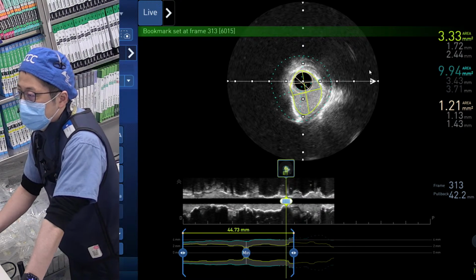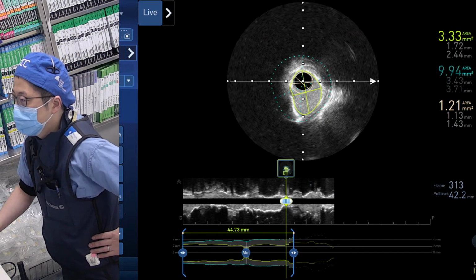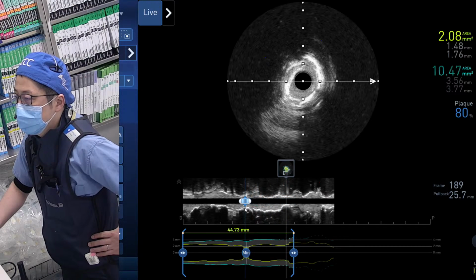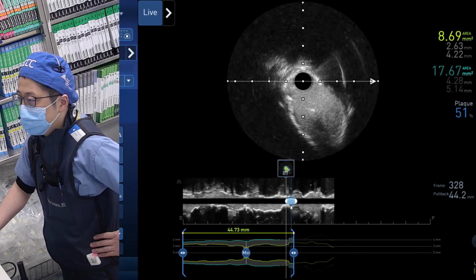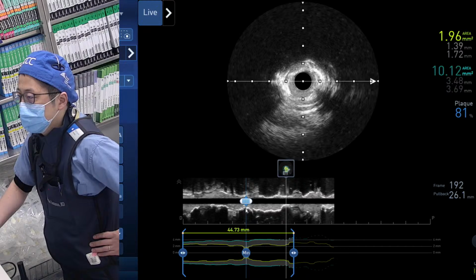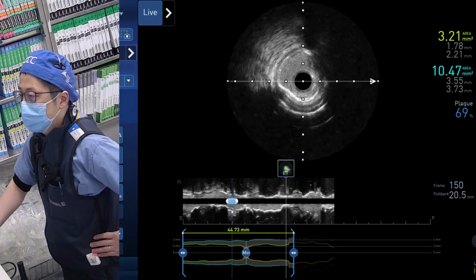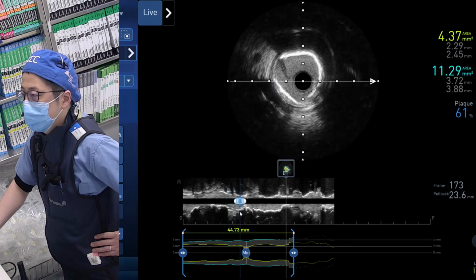Yeah, actually area-wise, it's like 3 point something at the ostium of D1. 270 degrees of calcium, not wide open. Ostium of the diag, area-wise, is 3.3. And the mid portion still has a lot of calcium with some nodule, the mid part of the diag. But we have done the balloon there. Did it open up or not?